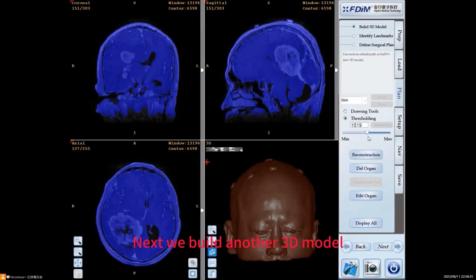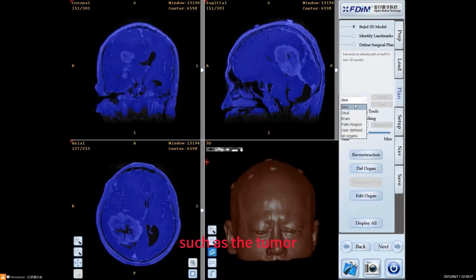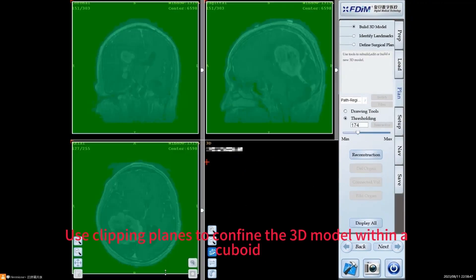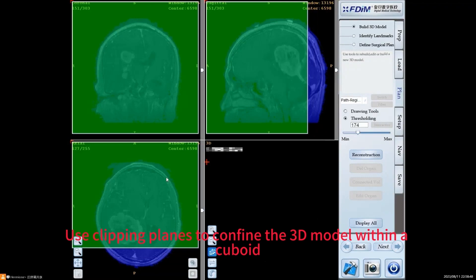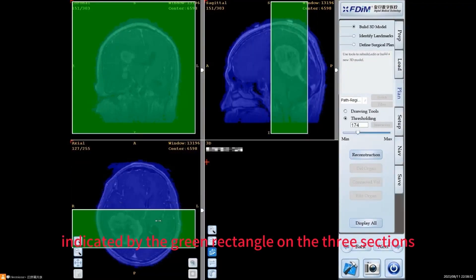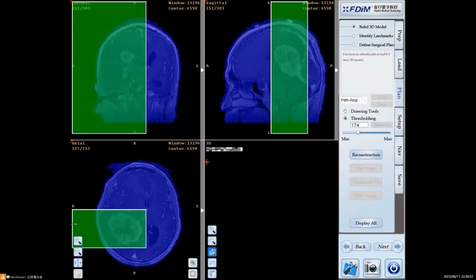Next we build another 3D model, such as the tumor. Generally tumors are small. Use clipping planes to confine the 3D model within a cuboid, indicated by the green rectangle on the three sections.